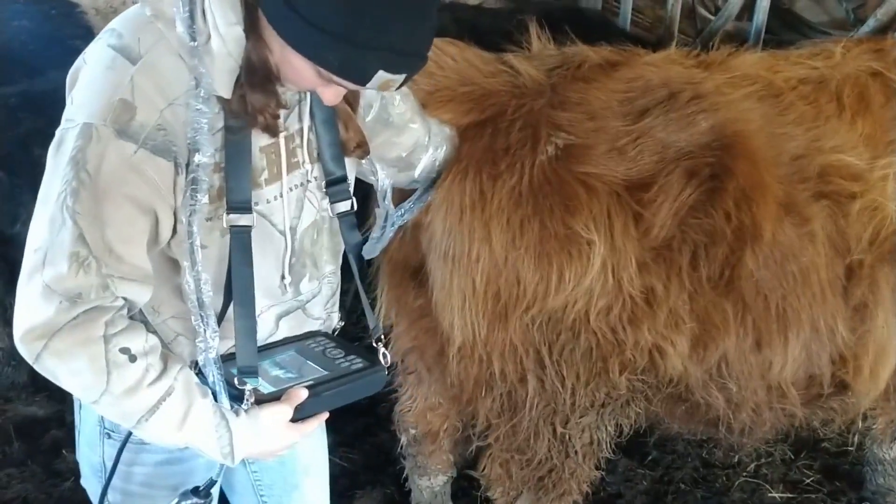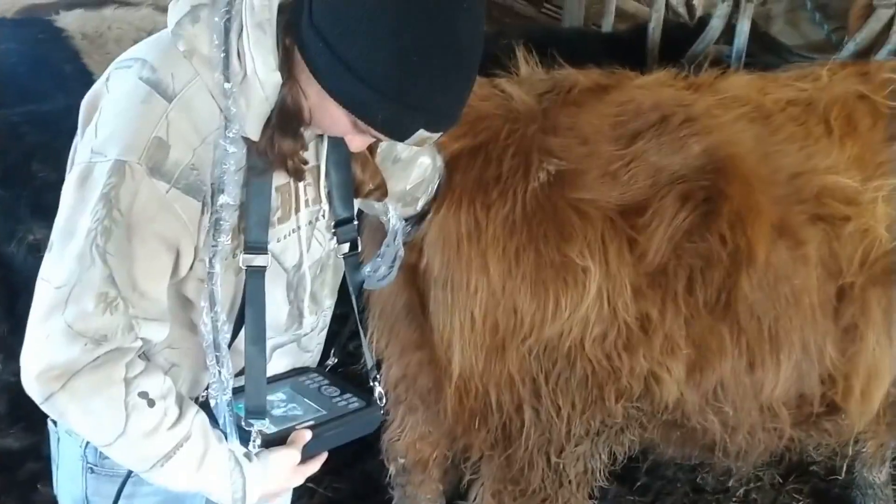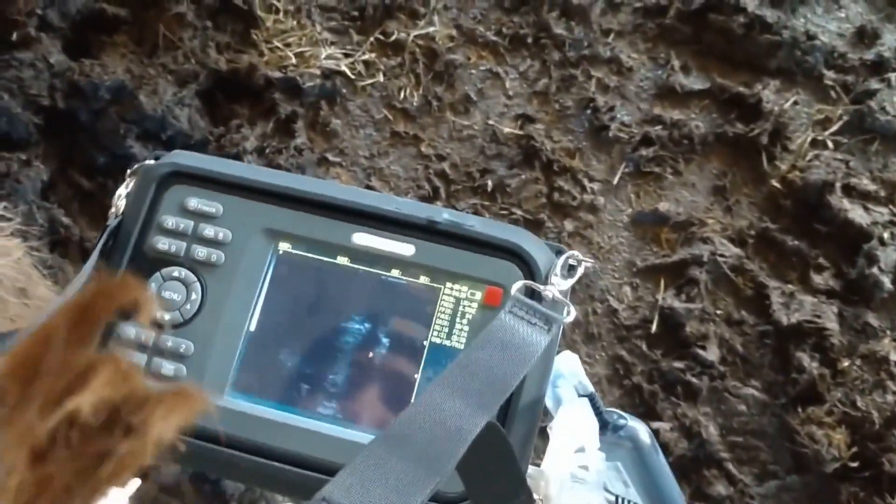As you can see, you use your hand to insert the probe just like you normally would. Let's see if I can get a good shot of the pictures — there we go.